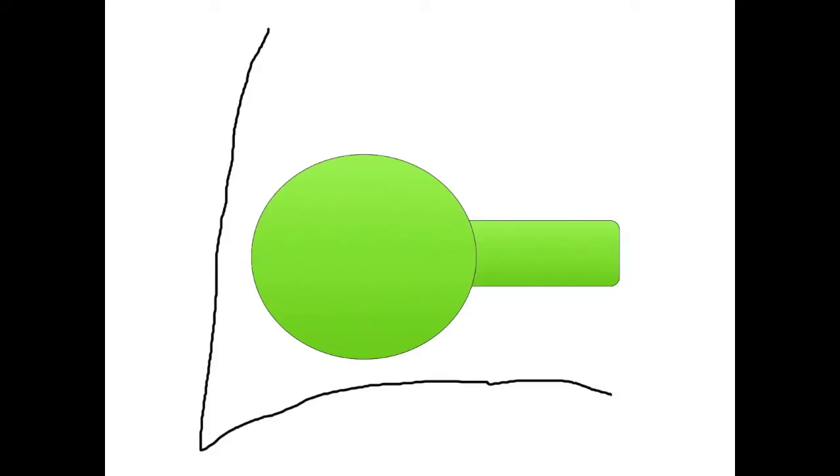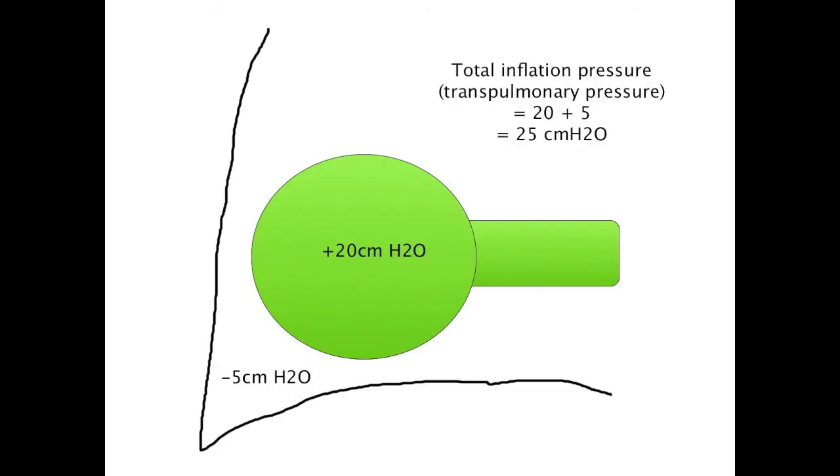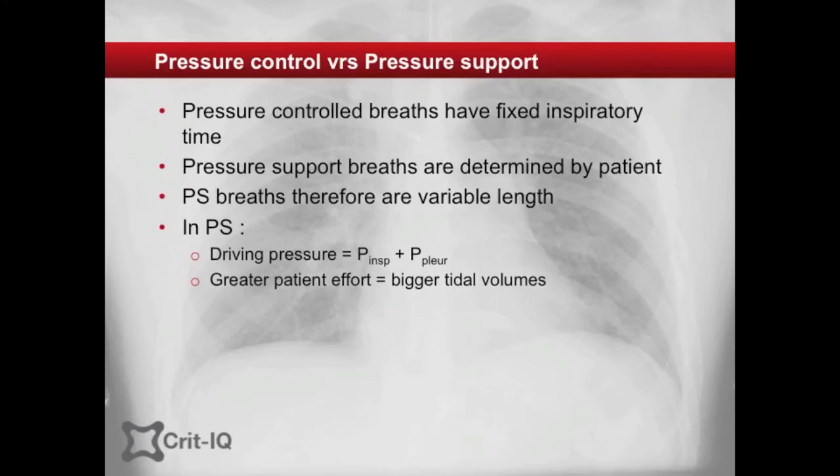Additionally, if the patient breathes in, this creates a negative intrapleural pressure that adds to the applied positive pressure, generating larger tidal volumes. The harder the patient breathes in, the larger the tidal volume will be. Given these facts, the patient is able to partly control the volume of these breaths, better matching their needs. This also applies to the pressure-supported breaths in SIMV mode.